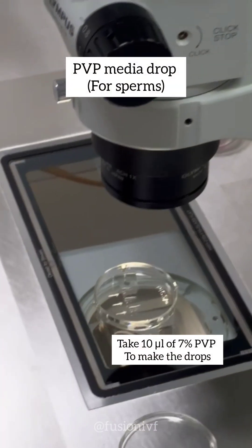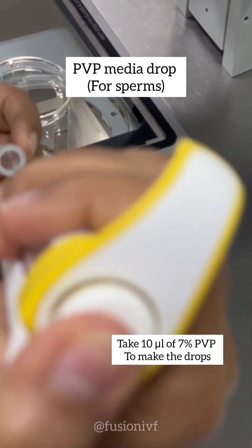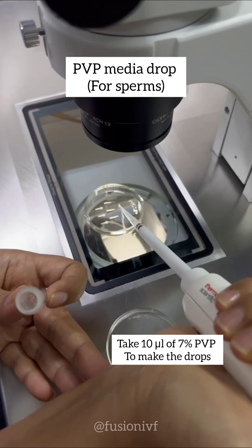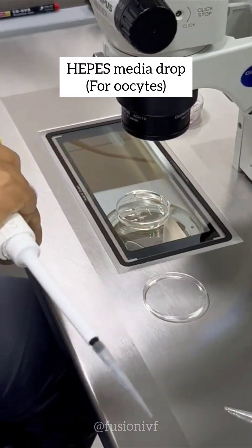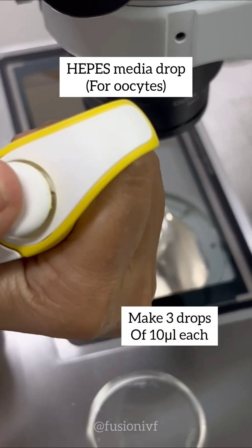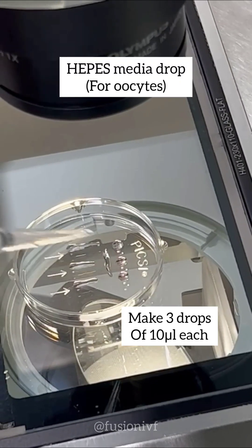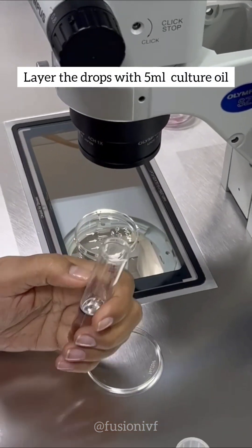Now I am putting the PVP drop — 7% PVP — and I am taking 10 microlitres of PVP. I am putting a cross drop and making three drops, then layering it with 5 ml of oil.